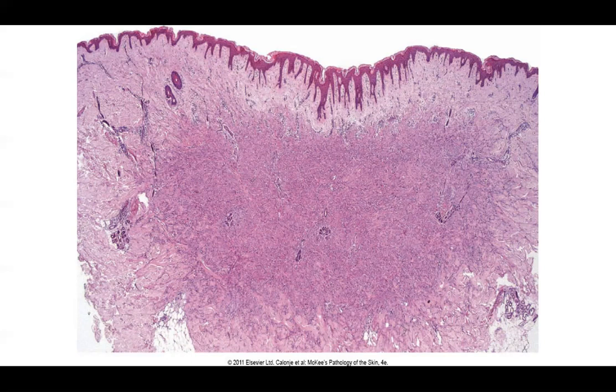I will point out, if you do a shave biopsy and you're trying to rule out a DF, many times you'll go from where my arrow is tracing and catch the superficial portion of the DF, and you'll see mostly just this acanthotic skin on top. Depending on the clinical rule out, I may be able to catch that it's just a superficially shaved DF.